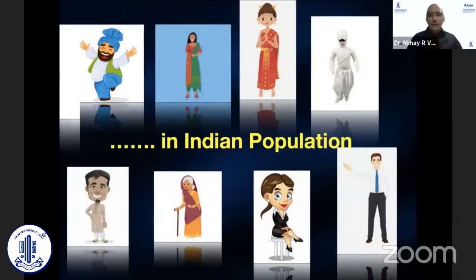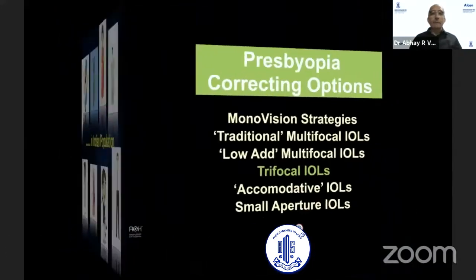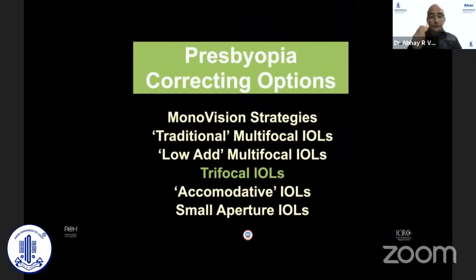I think we are unique in many ways, and therefore it's very important that we make this new technology very relevant for our dear patients. We understand the various options which have developed over the years: IOL-based, different multifocals and different trifocals, versus simple monovision strategies. The monovision strategies have been used by a limited number of people, and they enjoy that. But because the refractive target is not symmetrical and identical, the majority have an issue with them.